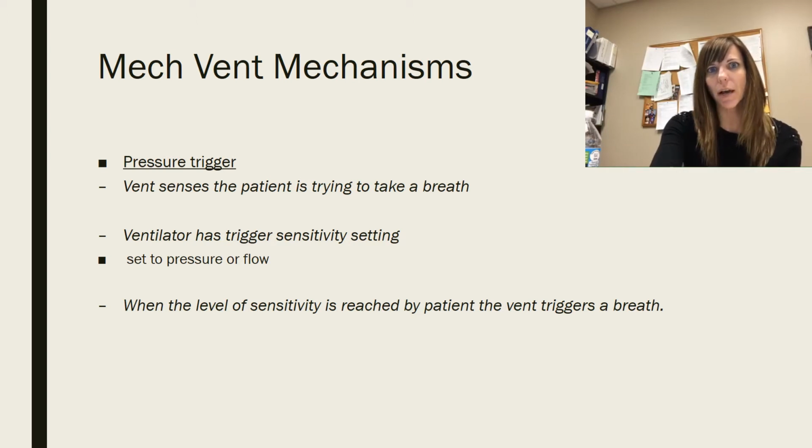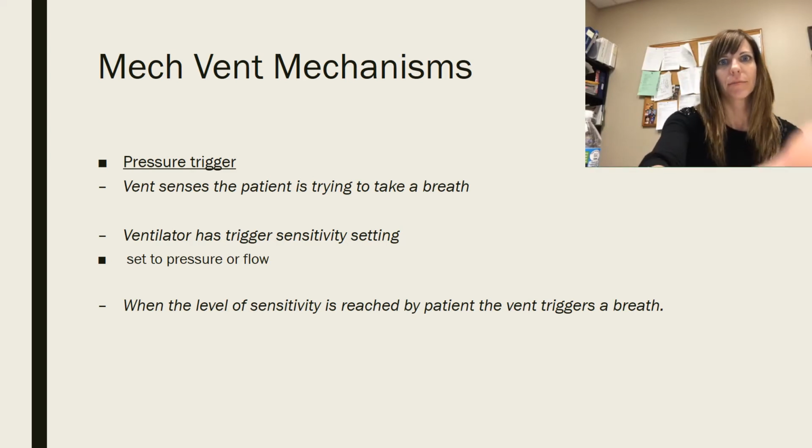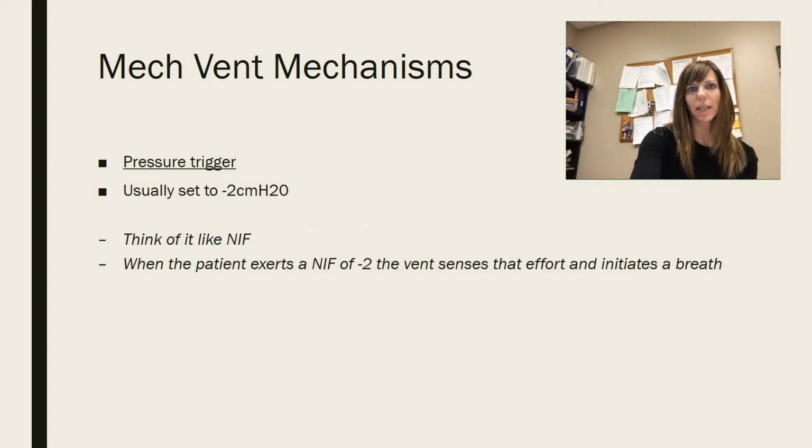It's just like IPPB. You guys sucked in, and when that pressure went to about -2, that pressure started. The breath started, i.e. the breath was triggered. As I was saying on the last slide, IPPB is a good example of a pressure trigger ventilator. Whenever you guys sucked into about -2, the breath was triggered.